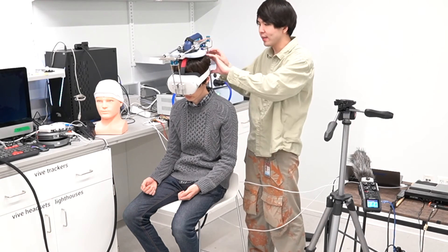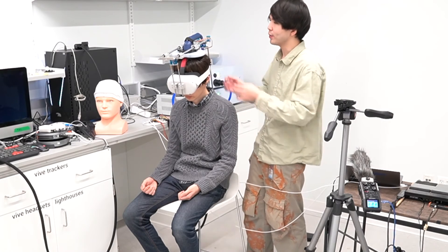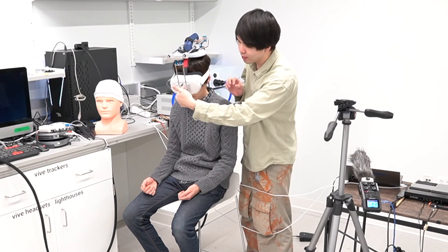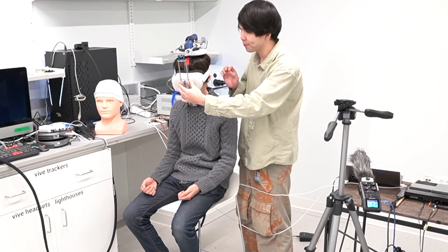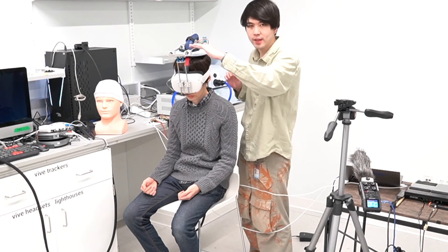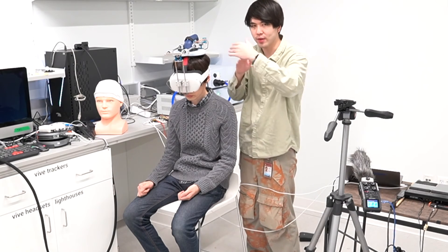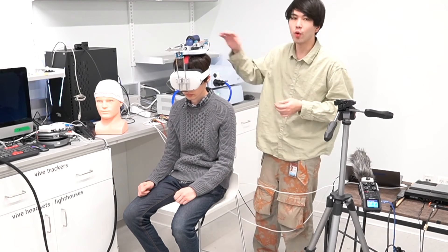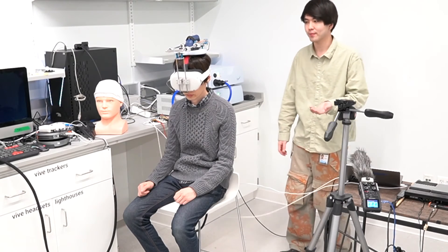And these are the primary components that are extending from the back of the VR headset device. But to support the weight of this coil and these motors, we have an extra mounting point at the front of this VR headset that is directly screwed onto this device mechanically. And also the main components, the frame of our device, are these passive rails and bearings that ensure that while we are moving this coil, the whole device can seamlessly slide and move the coil. So all in all, we evaluated that our device can robustly move the coil within the required precision of 8.5 millimeters. Thank you so much, Aki.